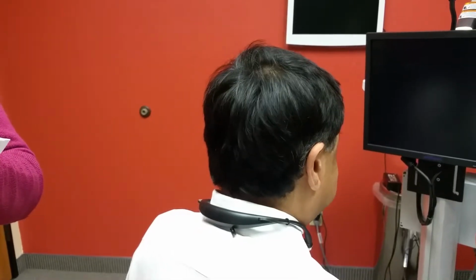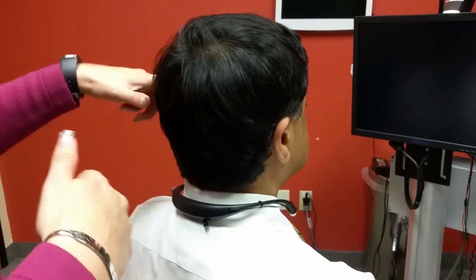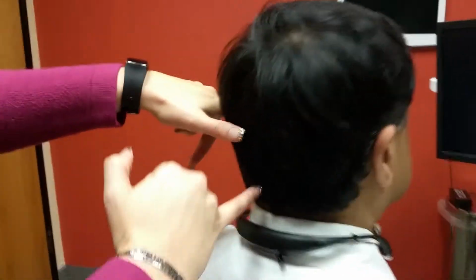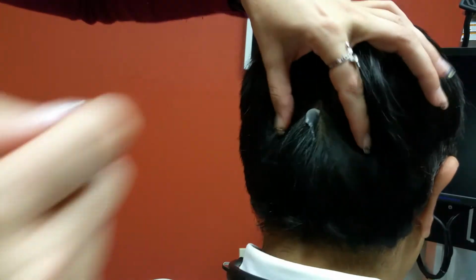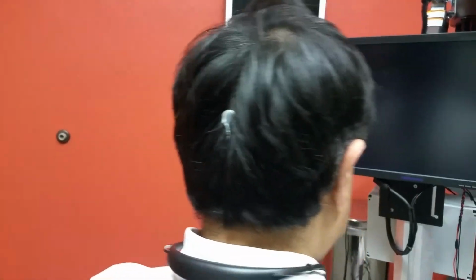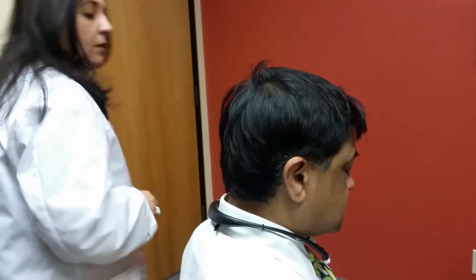So if you take a little bit of this conductive paste and put it on your finger, and we measure out exactly, chin up, nice and level, where we're supposed to go, nice and midline with his spine. We're going to be about right here. You can go ahead and mark this off. That way we don't lose it. Yeah, you're right. Thank you. Very nice too.